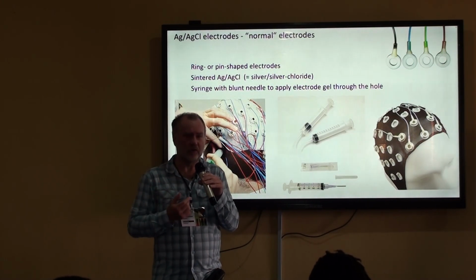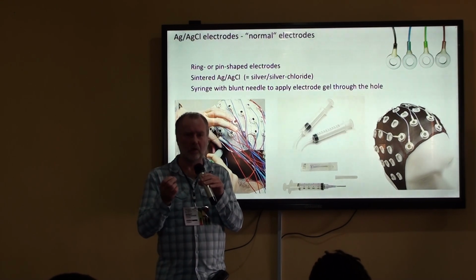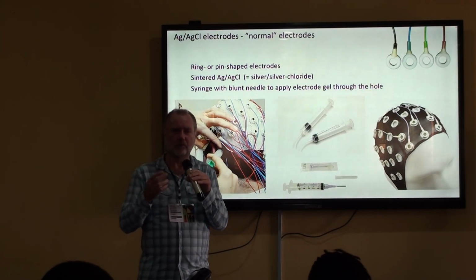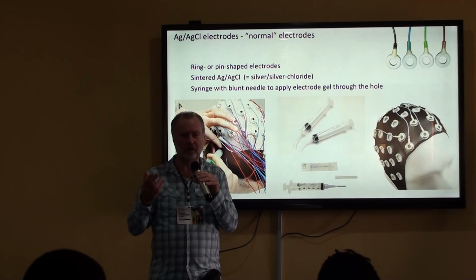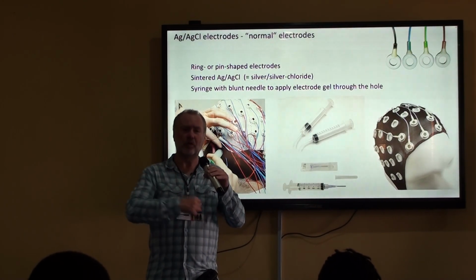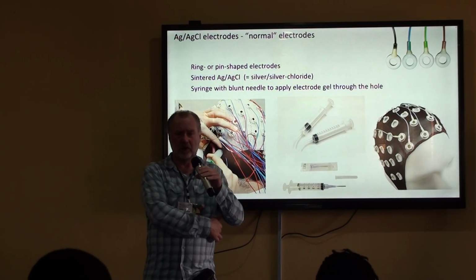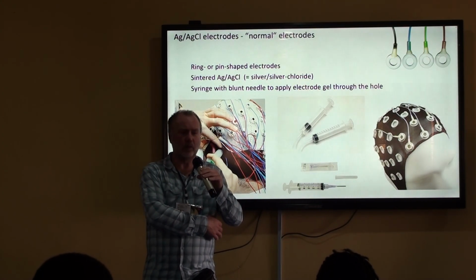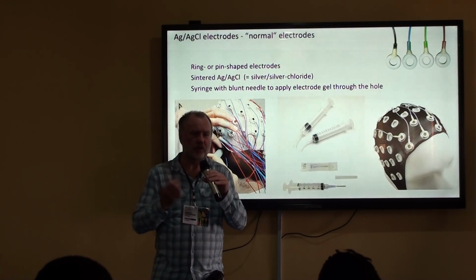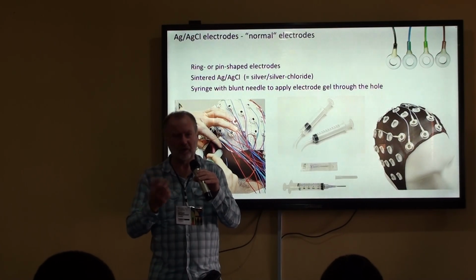I'm not a cardiologist, so I would typically not really study the ECG. I would only care whether there is heart activity that is correlated with the task. So I would, for example, use the ECG to monitor the heart rate. For clinical ECG, they would place an Einthoven montage with, I think, 12 electrodes over the chest, to study where specifically on the heart an infarct, for example, takes place. That is a level of detail that I would not care about as a neuroscientist.